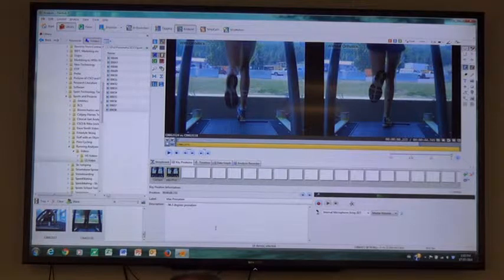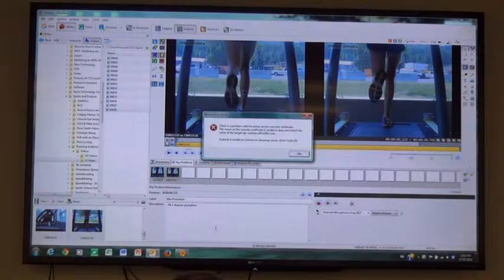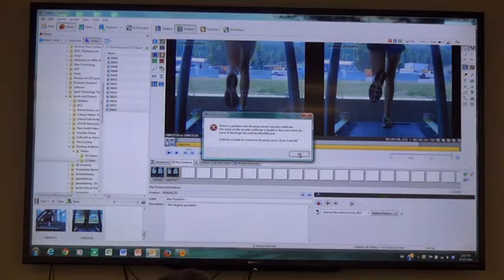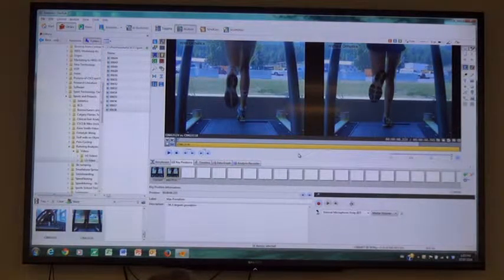The bigger question you have to ask is, is a 3-degree difference significant for helping reduce injuries? And further to that, is that difference in wearing the orthotics helping her with her injuries? We're assessing one aspect of her pronation. She has stress fractures, she might have iliotibial band syndrome or knee problems or whatever it may be.